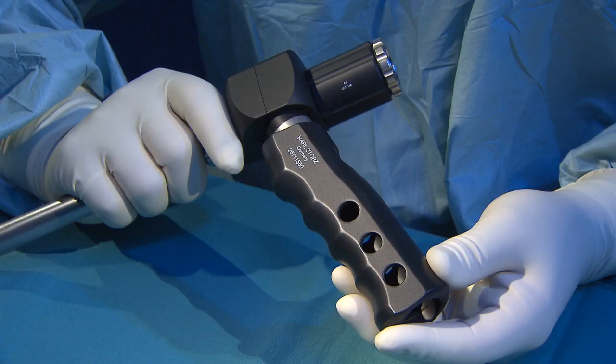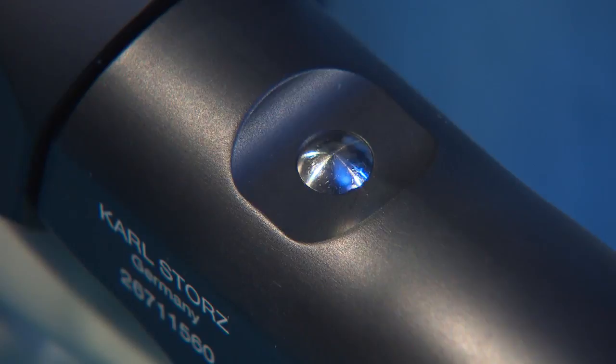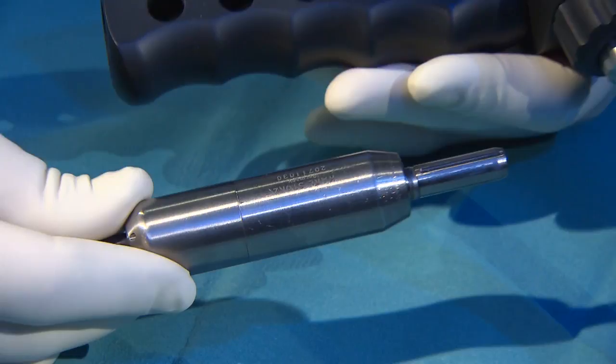The handle is locked on the gear unit with a safety button. The recess on the motor shaft should be precisely aligned with the lock marking on the handle. This allows the motor to be inserted easily and to lock into the handle with an audible click.